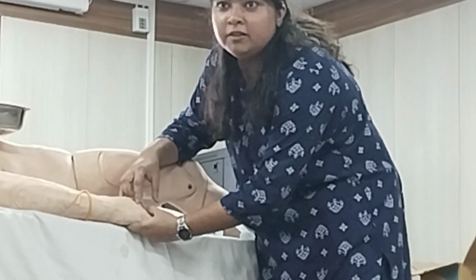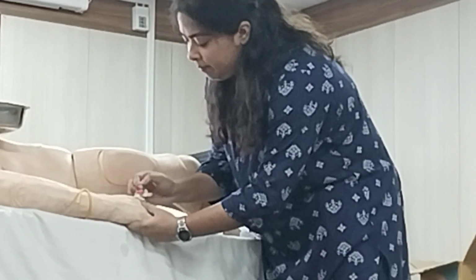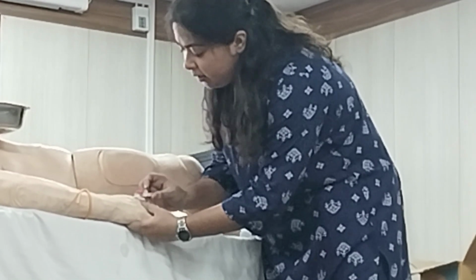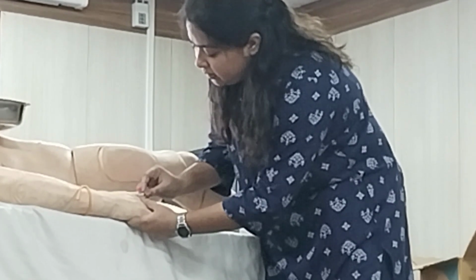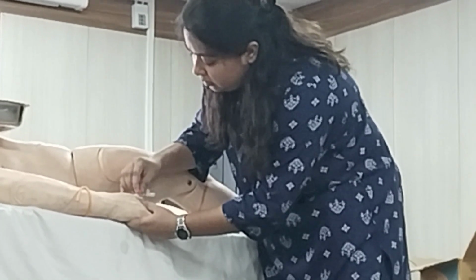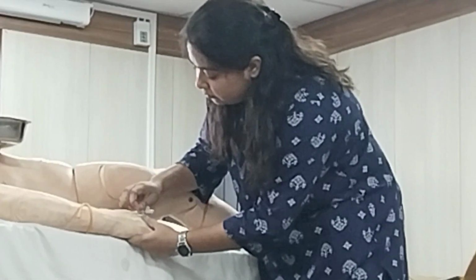While you are in the vein, you will get blood coming into the hub. So you know you are in the right place. Gradually push the cannula inwards, but the needle continues to be there, though partially withdrawn.